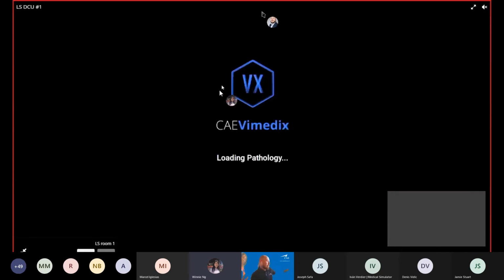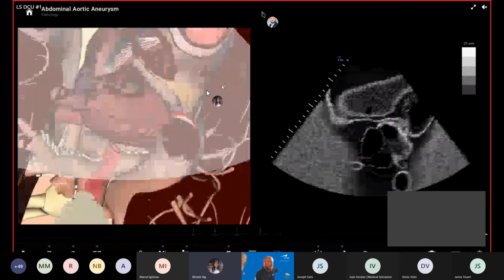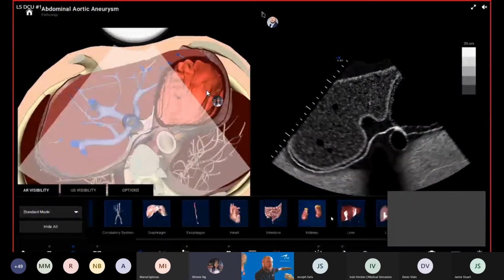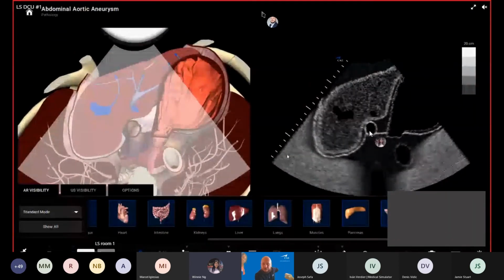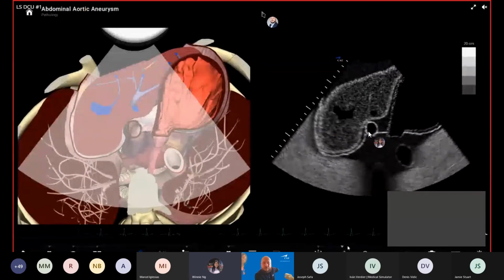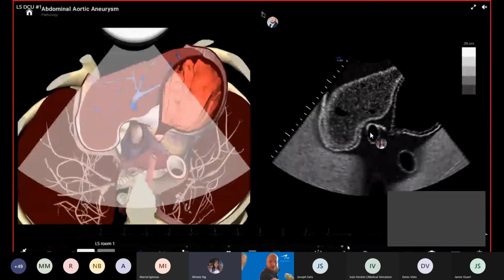Okay. So this could increase the interactions between colleagues in different areas and different locations. Besides that, we could use all those tools that Eric explained just now to do more interaction. So let's say I would say that Eric, maybe this one is the aorta. So he will know which one is the aorta and which areas he needs to focus on. So maybe I would tell Eric, okay, let's focus on these.